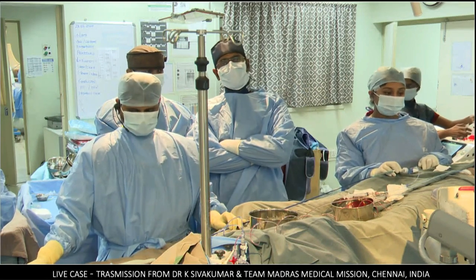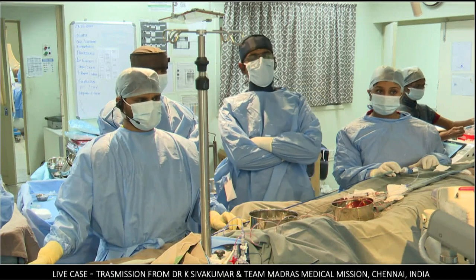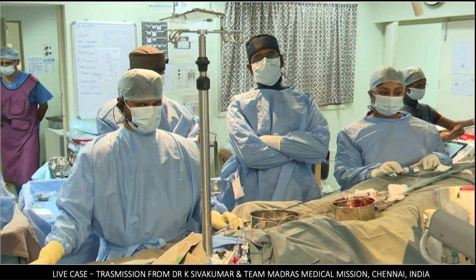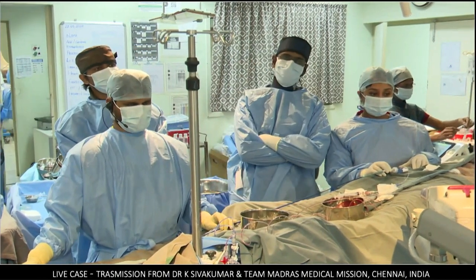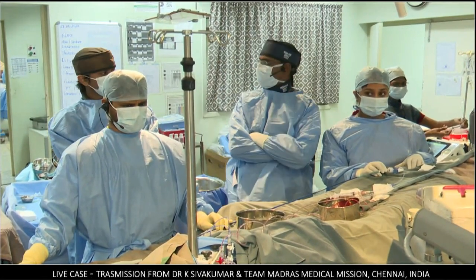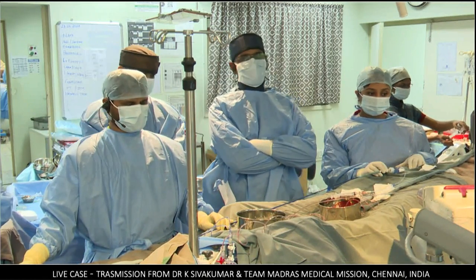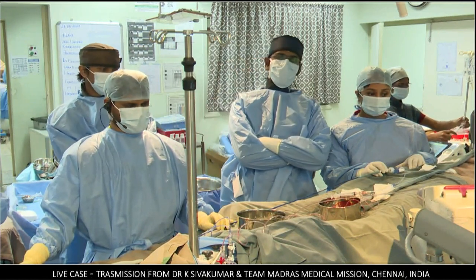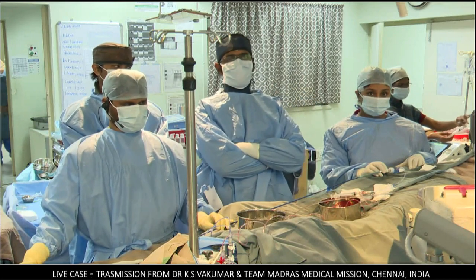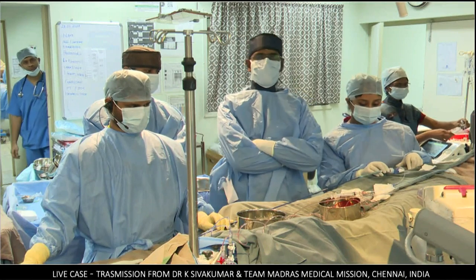There is no previous cardiac surgery, but there is an idiopathic dilatation of the pulmonary artery with free severe pulmonary regurgitation. Regurgitant fraction is more than 65%, almost 2/3 of the cardiac output is regurgitating back into the right ventricle, and the patient is increasingly becoming symptomatic. She's planning to soon get married and start her family, and so multiple considerations fell in place.